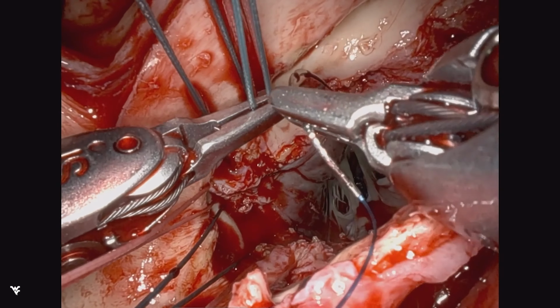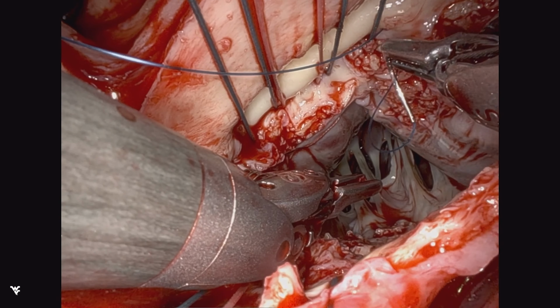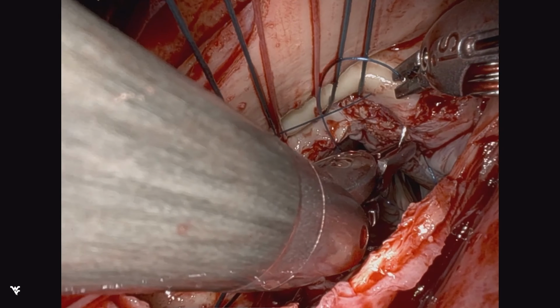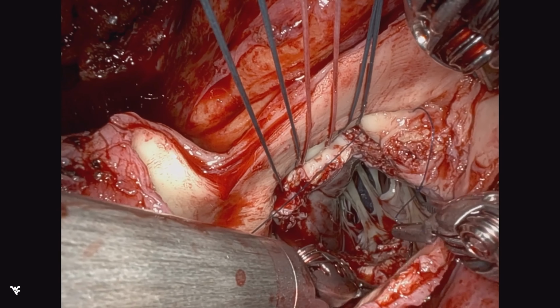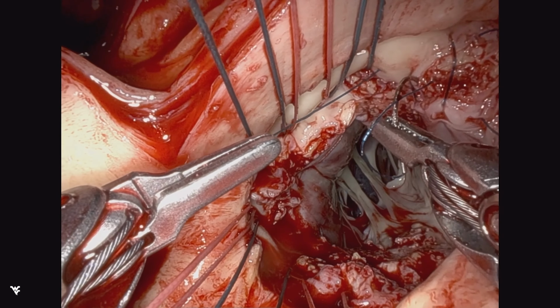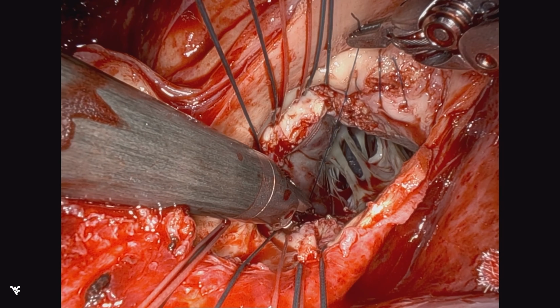But you can see that we did have a loss of domain here, and I'm a little concerned that we've had some minor annular disruption. So just as a safety precaution, I'm going to reconstruct the annulus here with a running 4-0 monofilament suture going up to just before the commissure, and then back along. This is about 50% of the right corner where we really had to be aggressive, as you may recall.